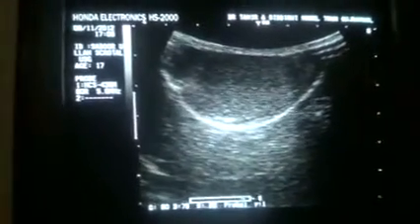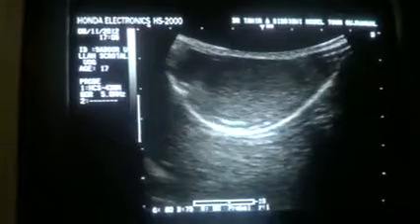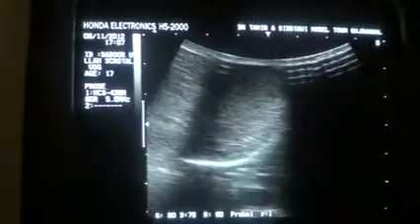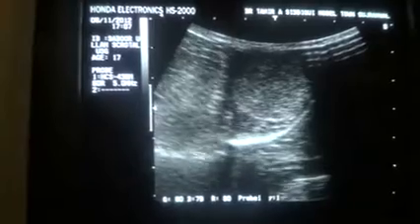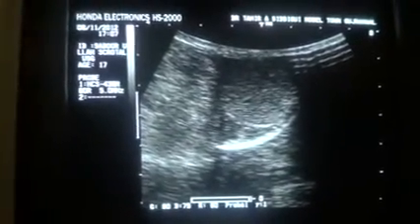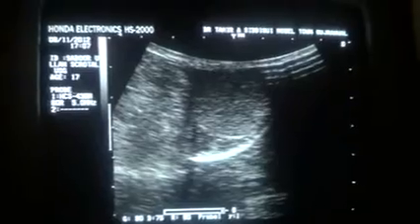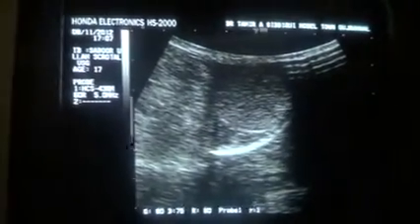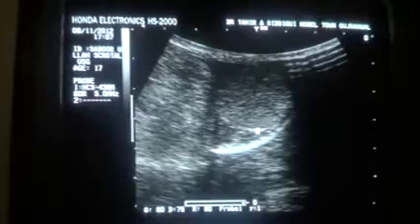Now this is the longitudinal section of the left kidney, and this is the transverse section of the, sorry, I may have said kidney, it is the testis, sorry, so please correct it. Initially you were seeing the longitudinal section of the left testis.